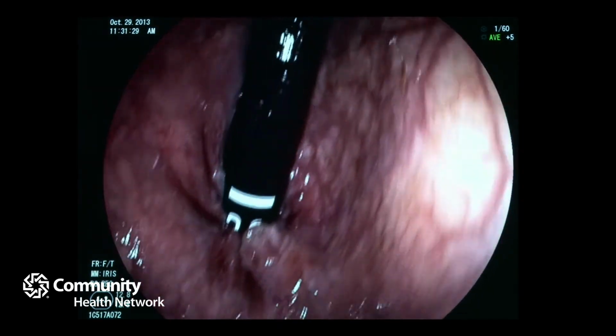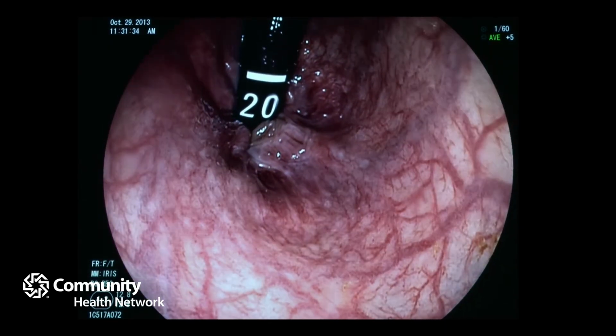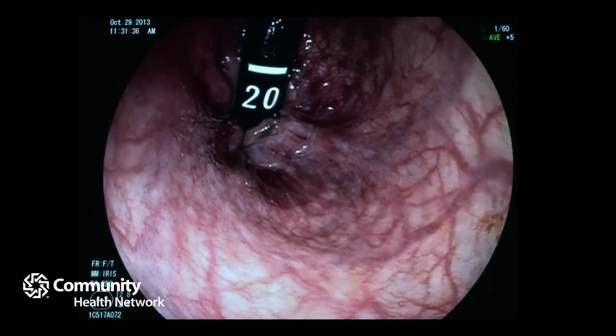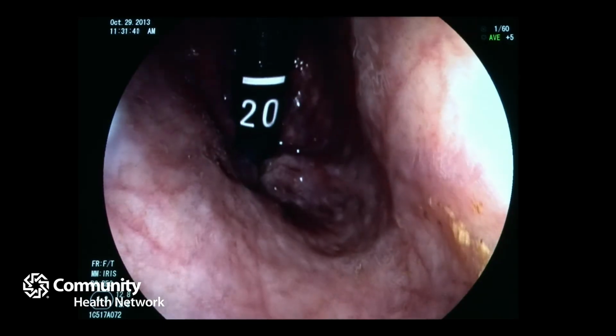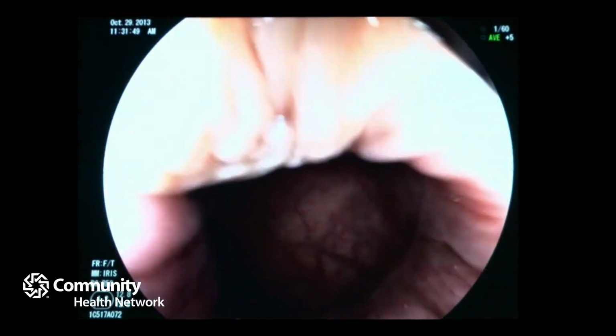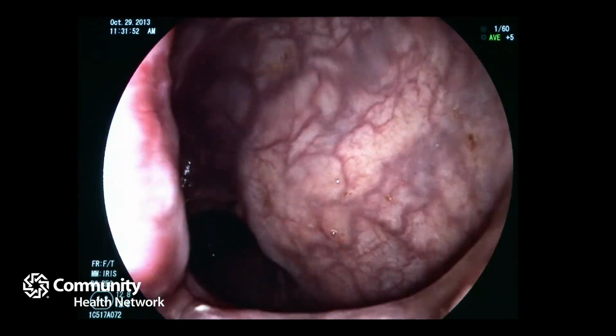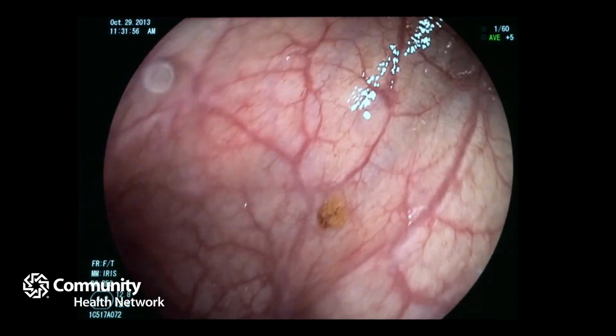So what I'm going to do now is turn the scope on itself. I have retroflexed, and that big thing sitting at about maybe 4 o'clock is a large internal hemorrhoid, and I can see the number on the scope. I basically flip the scope on itself. That's retroflexion. We often do an anoscopy, an exam with a little scope, to look at that area specifically, and you can also see it coming out. But you can see there it is at about 9 o'clock, that same one. But it's not always evident. That's why retroflexion is important also.